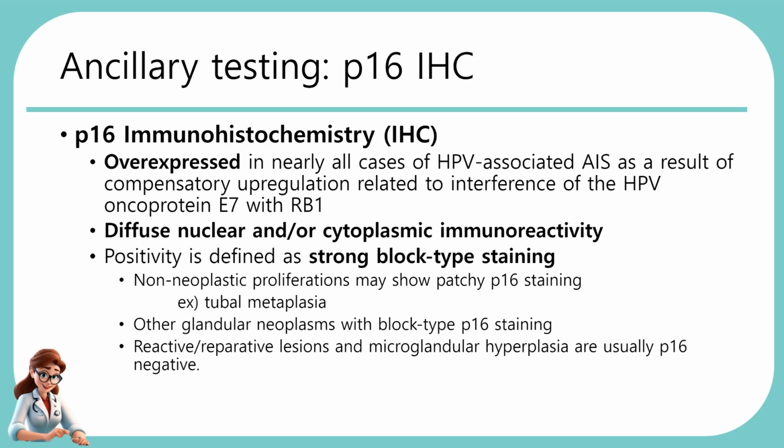It is worth noting that positivity is defined as strong block-type staining. As non-neoplastic proliferations such as tubal metaplasia may show patchy P16 staining, it is critical to distinguish between block-type or every-cell staining and patchy staining, with the block-type pattern being confirmatory of the diagnosis given appropriate morphology. One must also be aware of other glandular neoplasms with block-type P16 staining. Reactive or reparative lesions and microglandular hyperplasia are usually P16 negative.